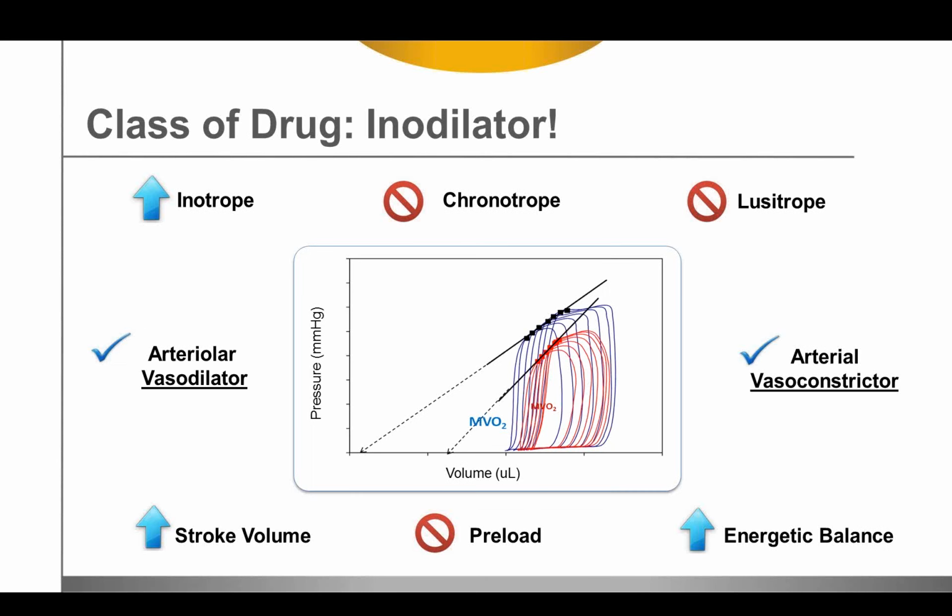Okay, fine. Now, from an analysis of the aortic pressure, the left ventricular pressure, and from dPdT, you would have predicted, I might add incorrectly, that this test article we're going to talk about now was a negative inotrope. You would not have known it constricts the aorta, you would not know it improves energetics, and you would not know it possesses no effect on lusitropy. So let's take a look at the PV loops.